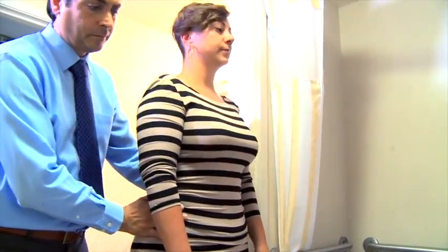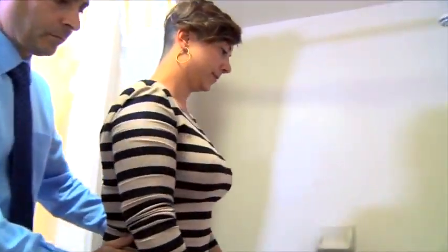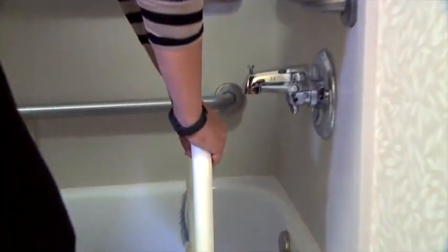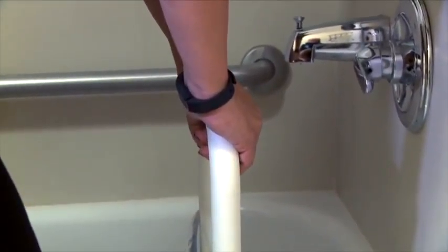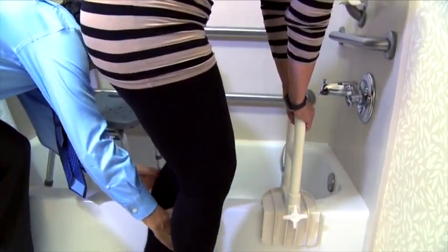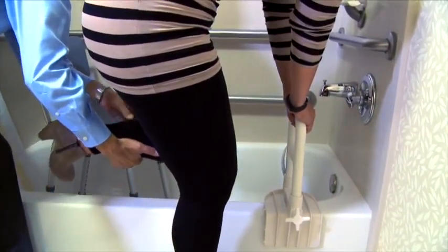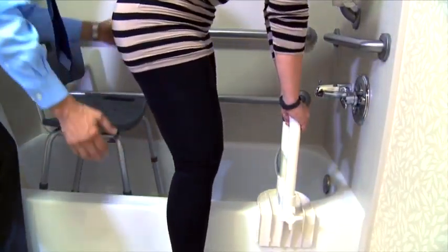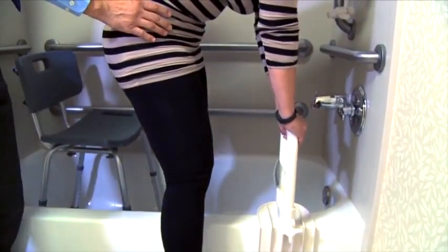When the person being assisted is full weight-bearing, they can use a tub bar. Have them face the front of the tub, grasping the tub bar with both hands firmly. Then provide assistance for them to step over the tub threshold with their first leg. Providing assistance for them to bend at the knee is usually more easy.